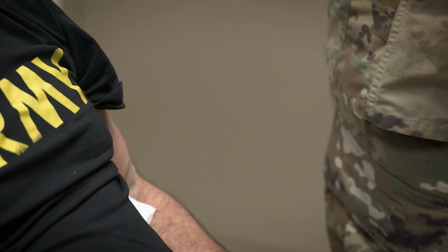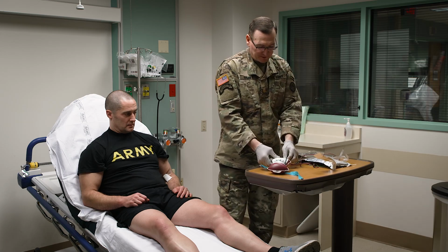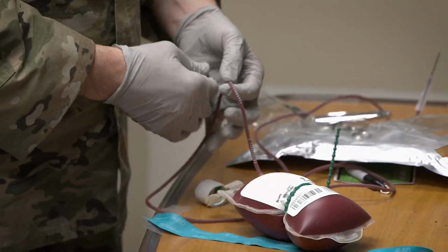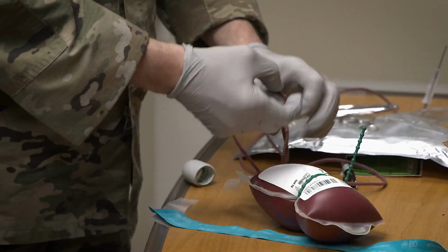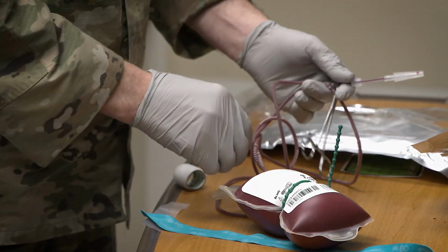Okay, let's talk a little bit about how to prepare this from here. You want to be able to tie 2 knots in this line close to the blood collection bag. You can also protect your sharp here to make sure you don't stick yourself.